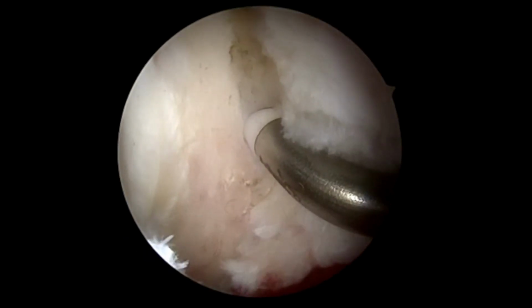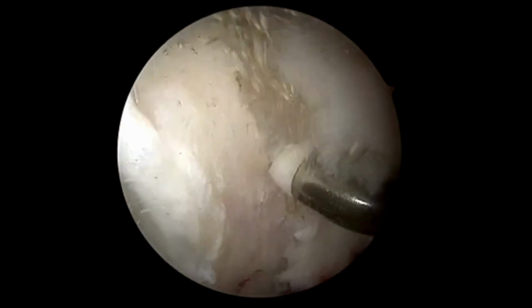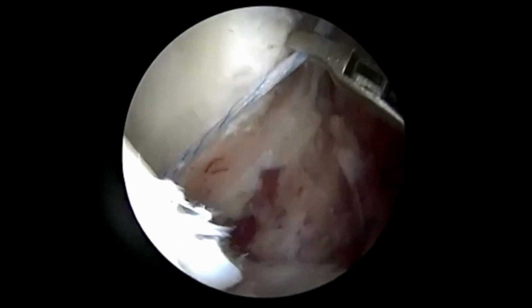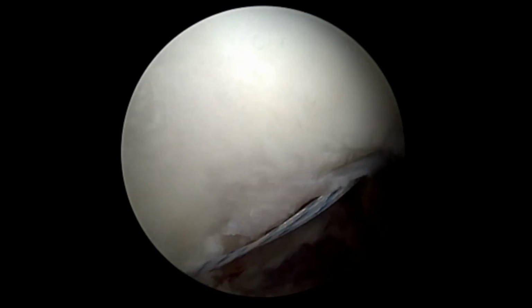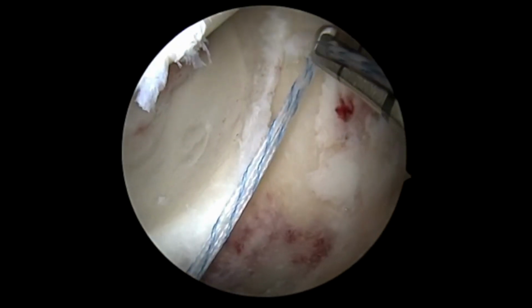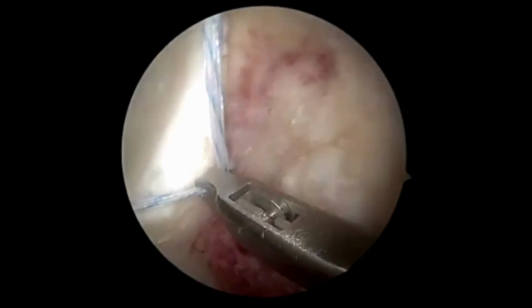Given the segmental labral defect resulting from the extensive labral ossification, we proceeded with preparation for segmental reconstruction. We placed our first anchor on the lateralmost extent of the labral tear with our arthroscope in the mid-anterior portal and the drill guide in the anterolateral portal. The defect was measured using a piece of suture from the anchor, which was placed along the acetabular rim in order to measure a curved surface.